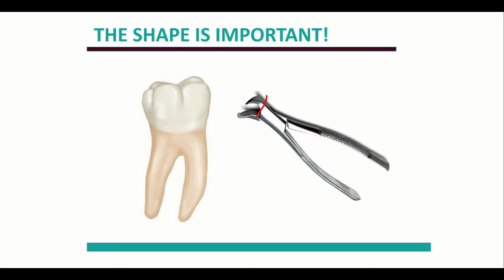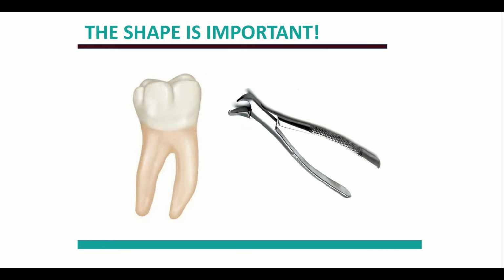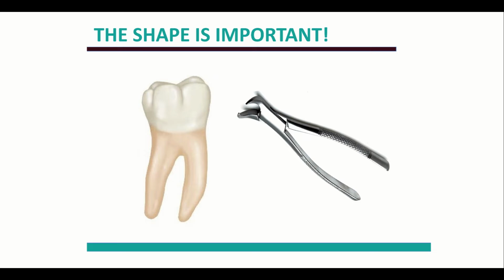Last one, and this is a very interesting one here. Notice that this particular forceps, the ends come to a point or prongs right there. And you'd say, well, what the heck? How would you use that with points to extract this tooth? You have to bury the prong into the tooth? No. What we actually do is we take these little prongs here on the forceps and we bring them down here.